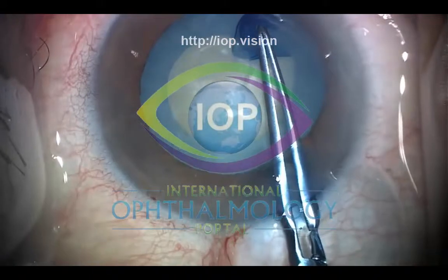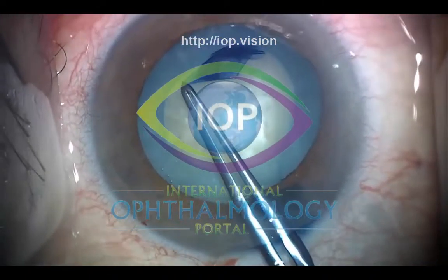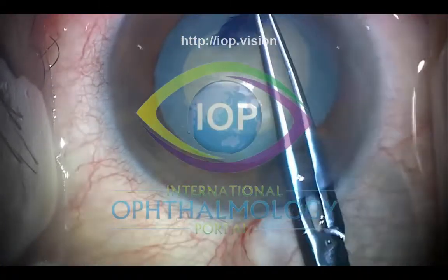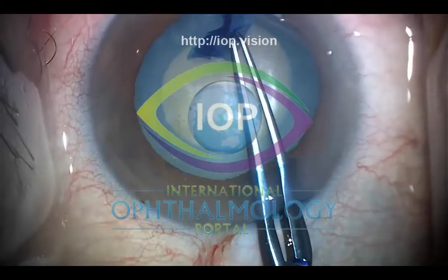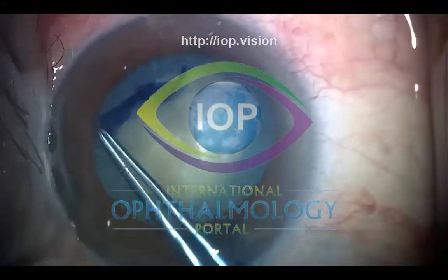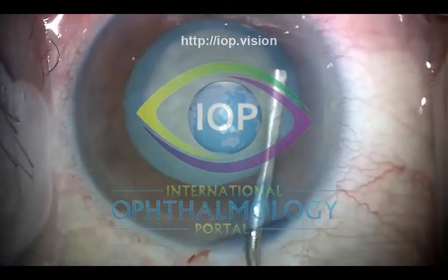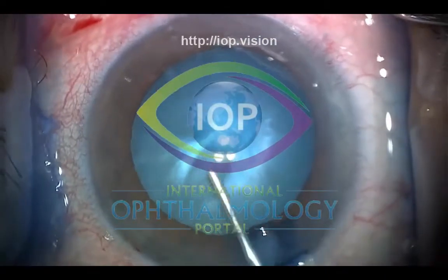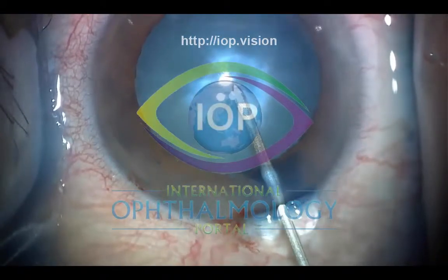We're continuing with the capsulorhexis here as you can see. Try and make as wide a rhexis as you can, but as safely as you can, because some of these lenses can be quite big and difficult to get out. Particularly in the angle closure situation, you just need to control the rhexis. You can see it proceeds fairly routinely now that you've decompressed the lens, and the case really from this point on proceeded in a fairly routine manner.